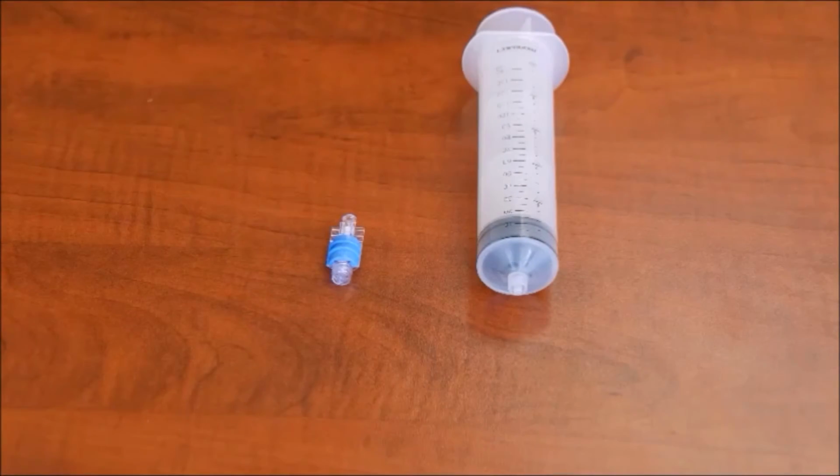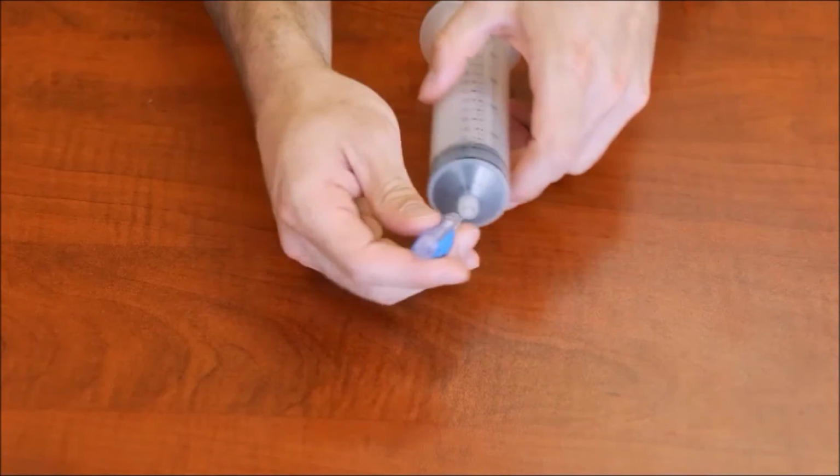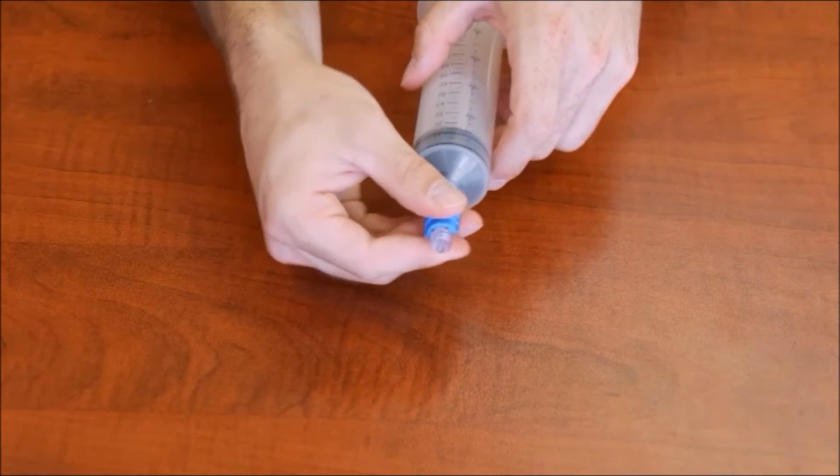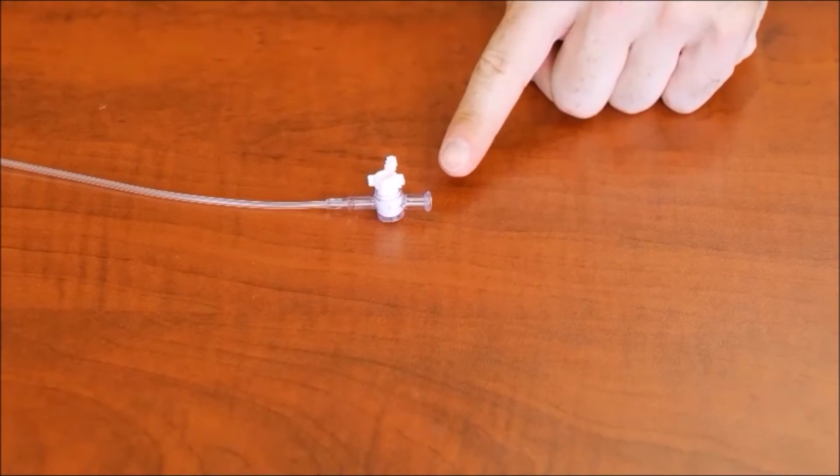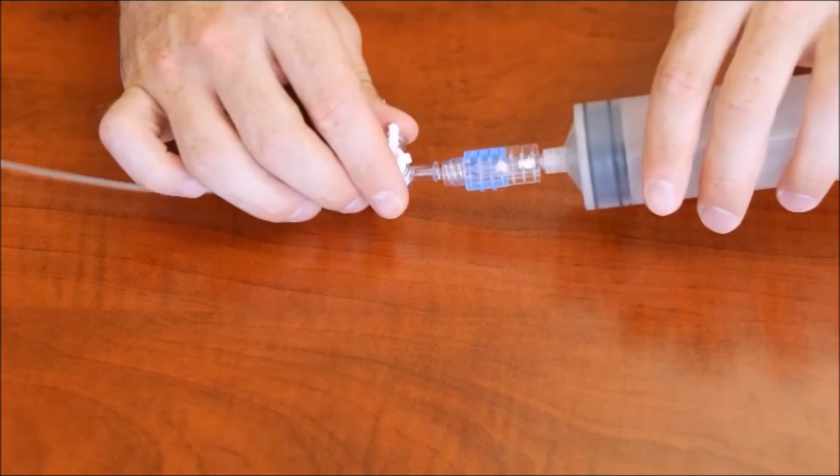Now let's walk through how to control the airflow to the rectal balloon. First, attach your flow control switch to the syringe. Once that is completed, attach the syringe and flow control switch to the bottom opening of the long extension tubing of the catheter.